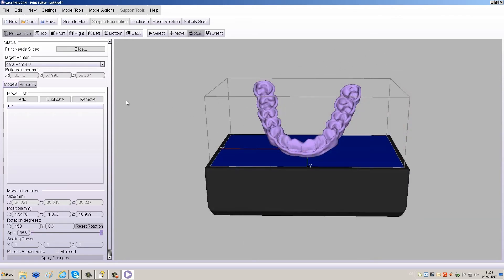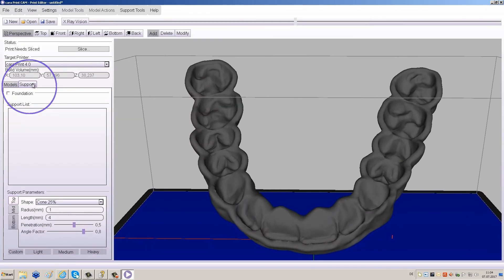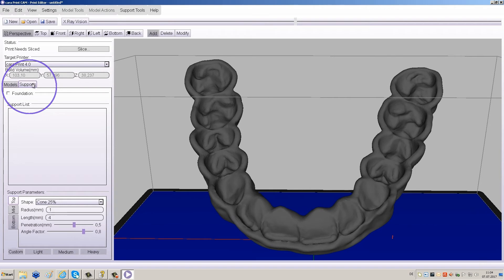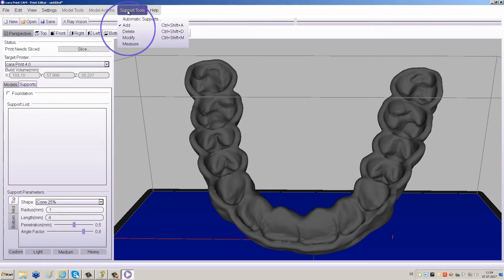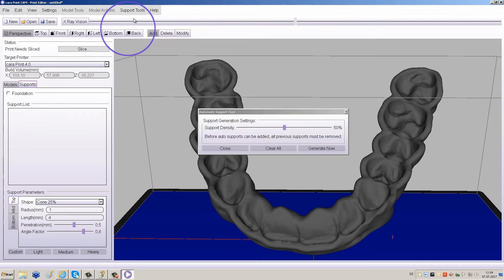Click the Supports tab to the left of the screen to activate the support menu. Click on Support Tools at the top of your screen to view the support tool options. Click Automatic Supports to open the Automatic Support tool.